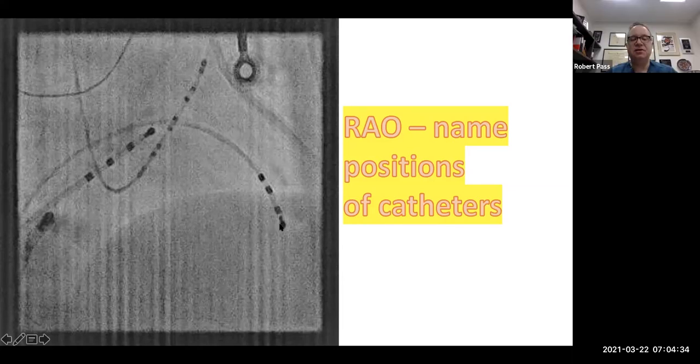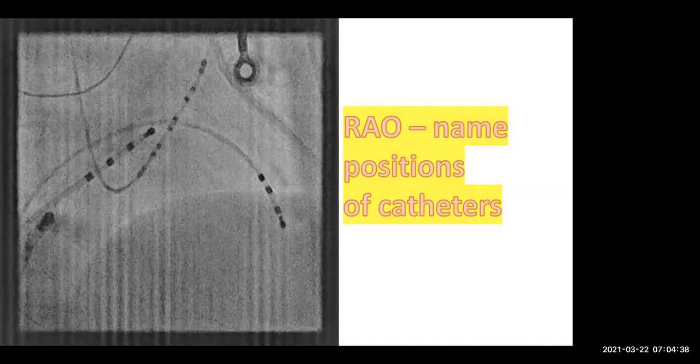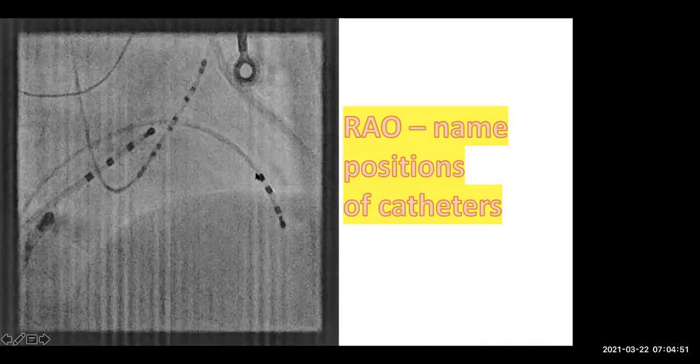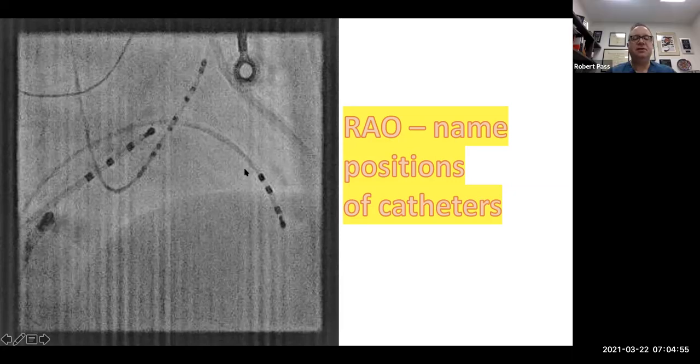So what is this catheter, do you think? It looks a little bit low for my transeptal, but I'm wondering because it could theoretically be transeptal and be sitting in the left ventricle, but it's in the right ventricle. Oh, okay. So my RV catheter. Right. So we have, here's the RV catheter coming from the IVC. This is the His catheter.